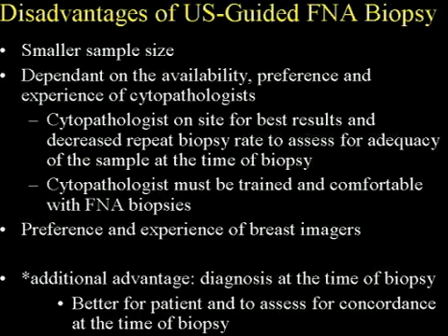So if you actually do FNAs and have cytopathologists that are comfortable, it's an excellent technique if you're able to do it. The other advantage is that you get a diagnosis at the time of biopsy, so you can tell the patient at that time what their diagnosis is, and also you can assess for concordance at the time of biopsy, which I think aids in correlation of biopsy results.